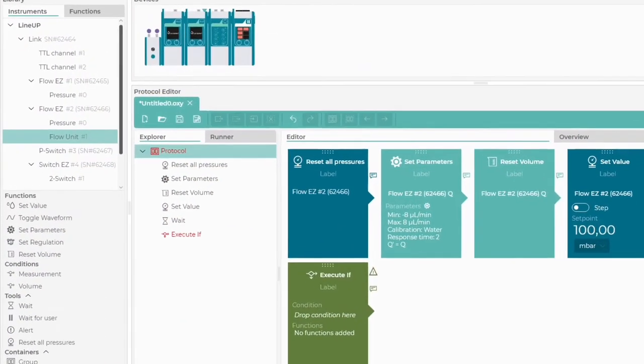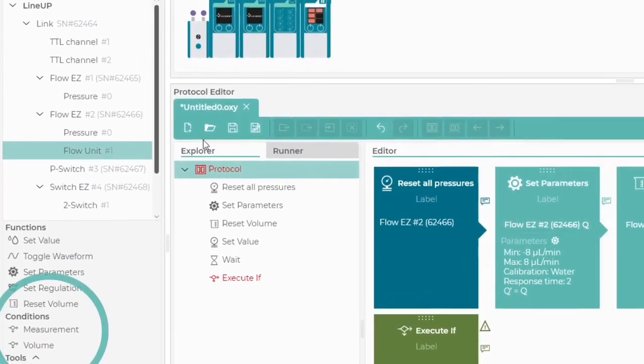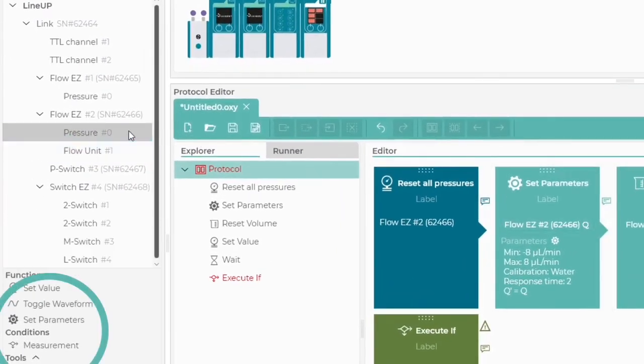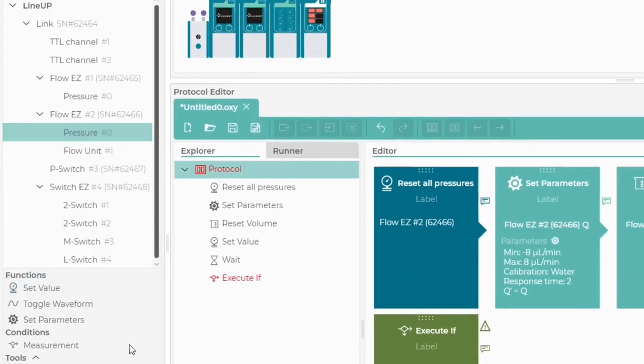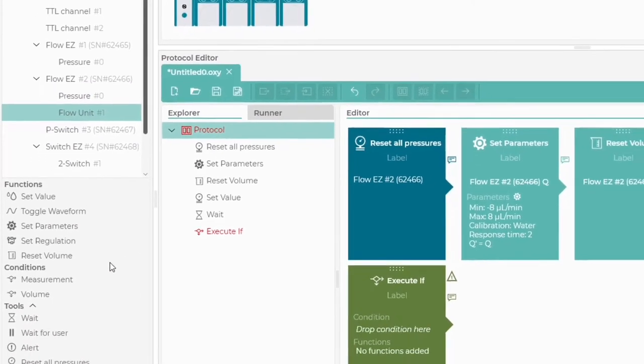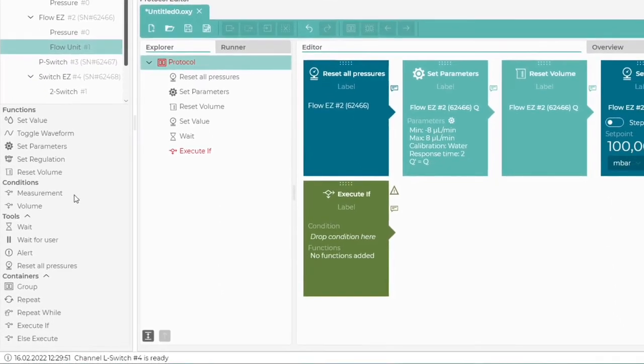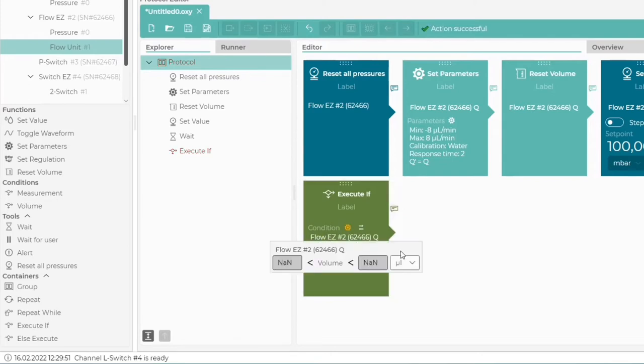Remember, different devices have different conditions at their disposal. As we measure the volume with a flow unit, we select its corresponding item from the Instruments section. Then we simply drag and drop the volume condition into the Execute If box. The settings are activated immediately after we add the condition.